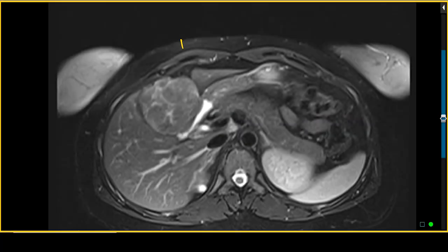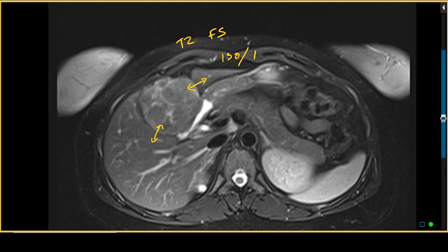On the T2-weighted sequence performed with fat saturation, we can again evaluate the signal within this lesion. We use these turbo spin echo fat-sat sequences to determine the T2 content of these lesions. Again, it looks quite similar to the adjacent liver parenchyma — iso- to slightly hyper-intense on T2-weighted images — and it clearly has clefts within it that are much more T2 hyper-intense.